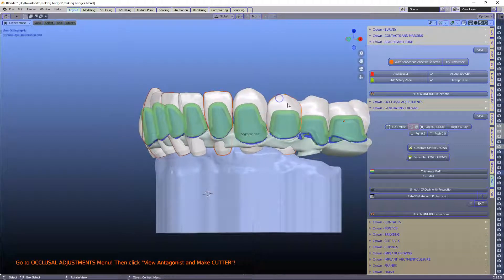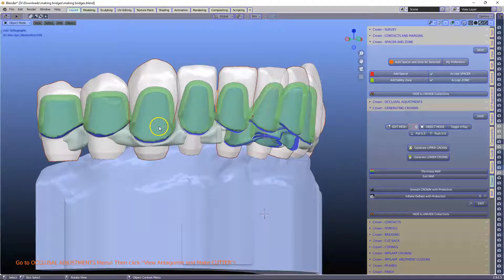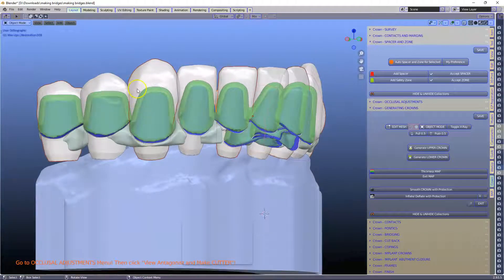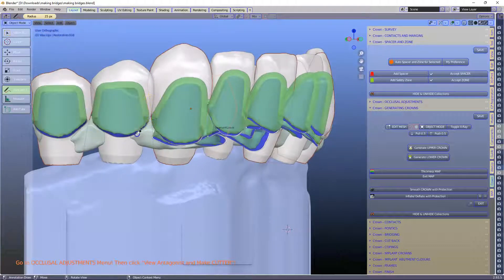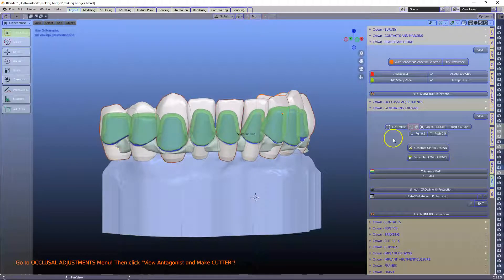I'm going to select the alternate teeth, and this is for good reason — I want to generate them all in one go. I can't use adjacent teeth because the mesh is going to find the closest edge loop when creating these. If we have teeth very close together, this one can jump to that one, and we don't want that happening. So I've got every alternate tooth selected.